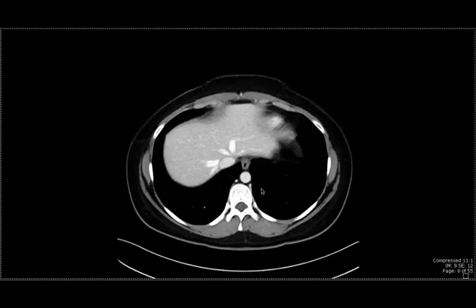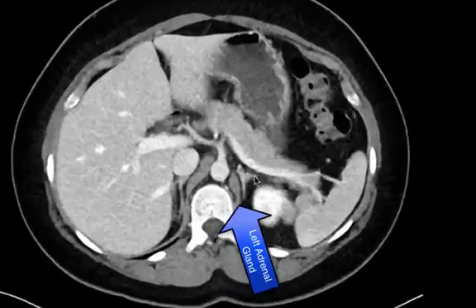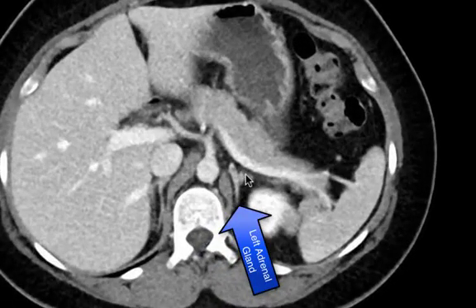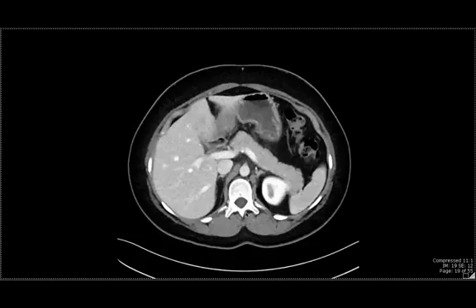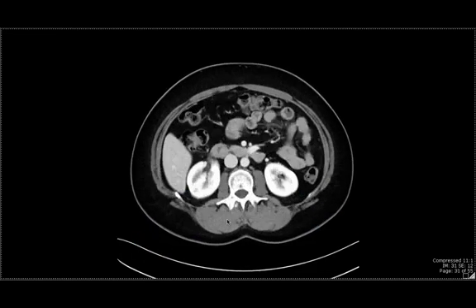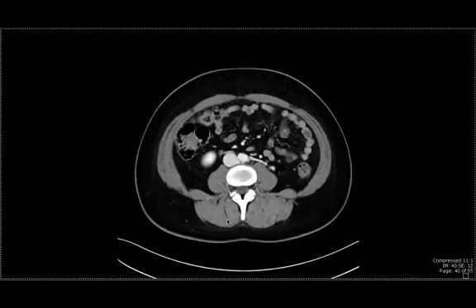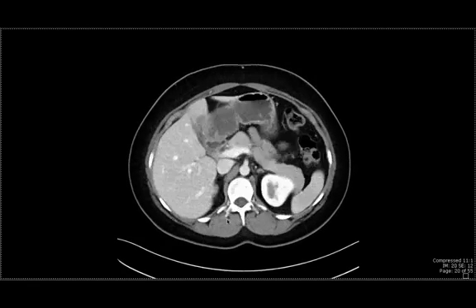The next organ I'd like to showcase to you is the left adrenal gland. We can see it nicely over here, and it has this kind of triangular shape. And we'll see that again on the coronal slices. You can appreciate that triangular shape nicer on the coronal slices. On this image, we can also see a portion of the right adrenal gland over here. As we scroll downwards, we can see the left kidney and the right kidney. So we can scroll all the way down to get the full extent and back up again to see what the kidneys look like in the axial plane.